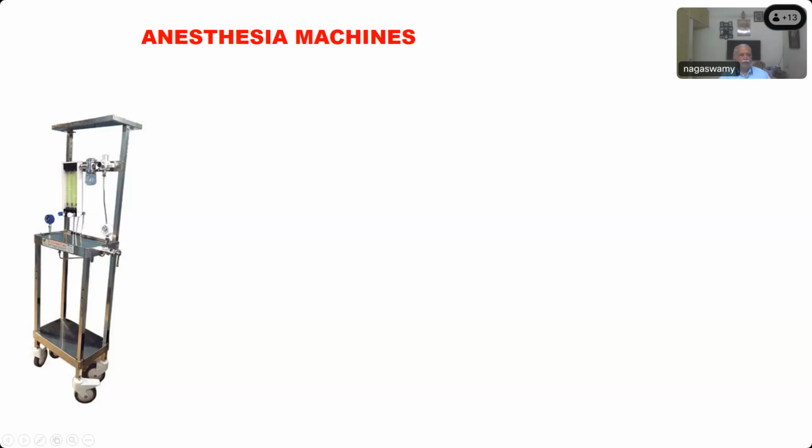And what is this? What you see here? Vaporizers. What type? What is the vaporizer called? Somebody wanted some information on the history of anesthesia also. I think Muttumani wanted to know about the history of anesthesia. You will get questions on that also here and there. Goldman vaporizer. Very good. What are the characteristics or features of this Goldman vaporizer? Has it got any temperature compensation?